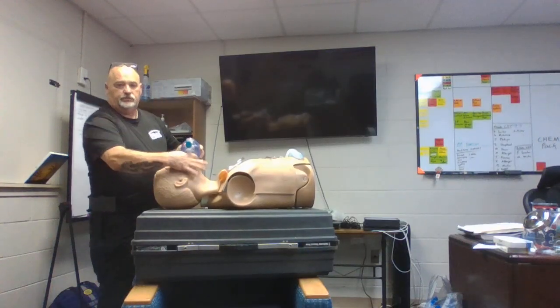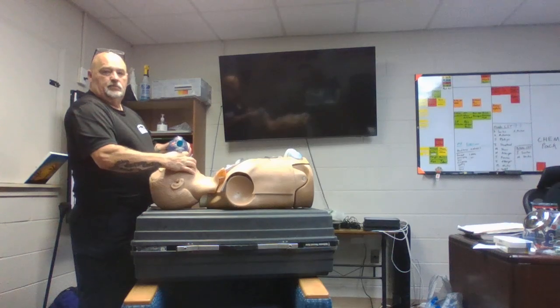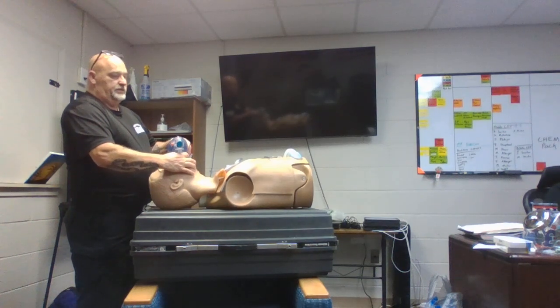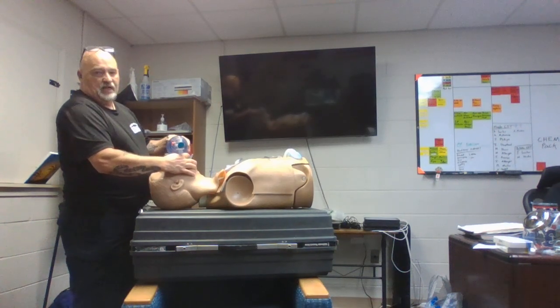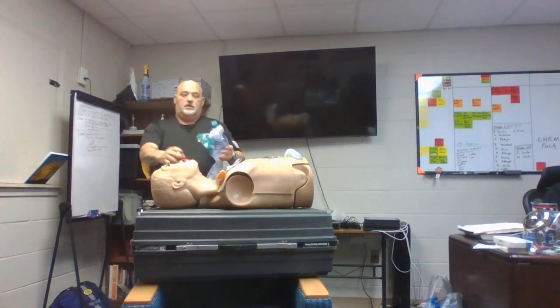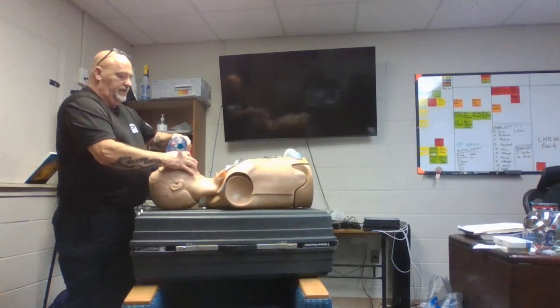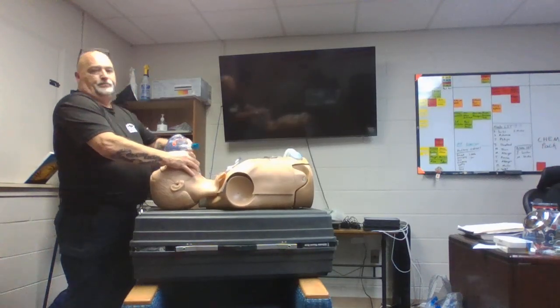You still do that, the C and the E, right? You want to still pull that airway open and squeeze just enough to get it to rise and fall. That's all we're looking for. We're not looking for, like I said, how many times have you walked in and you see them take that bag and crush it, right? They're crushing it.